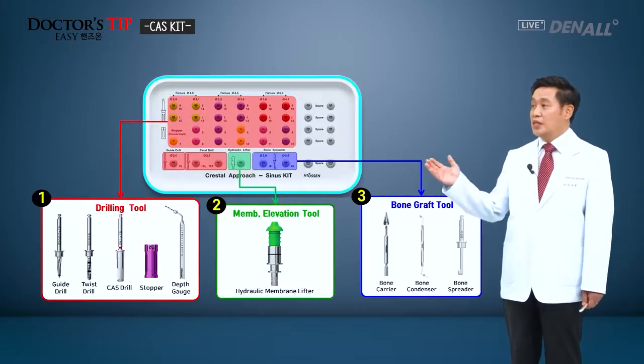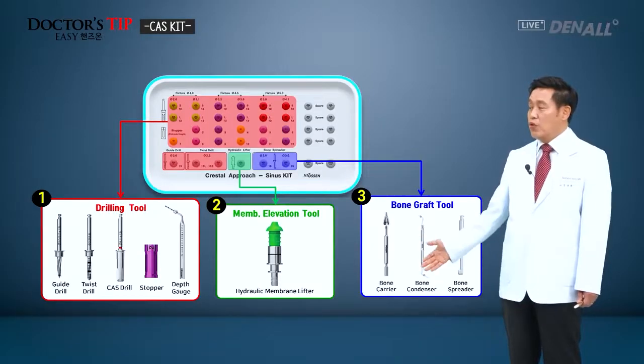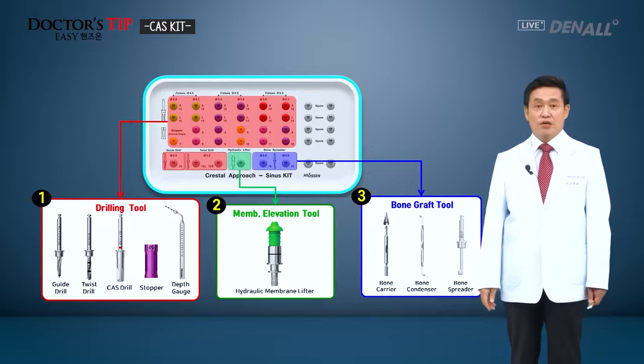Components of the CAS kit. Basically, there are drilling tools in the CAS drill. Second, after penetrating into the sinus floor, the sinus membrane can be easily hydraulically elevated using the tool, and the bone carrier and condensers are in the bone graft tool. 3 types of tools are available.